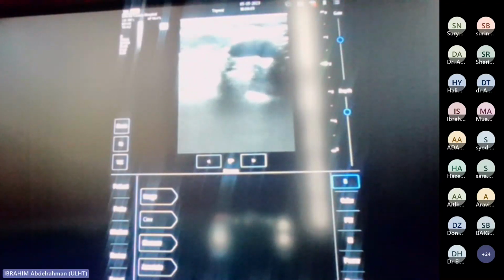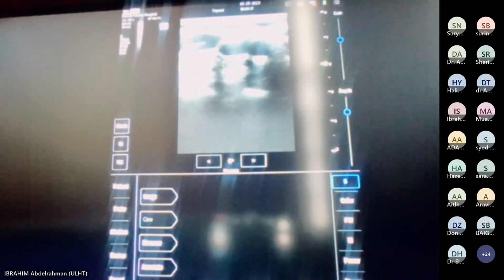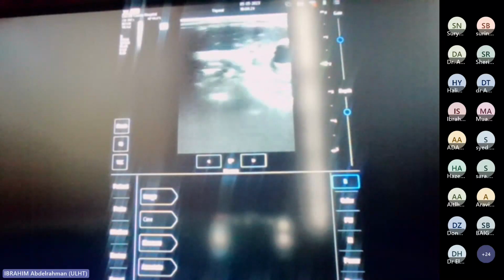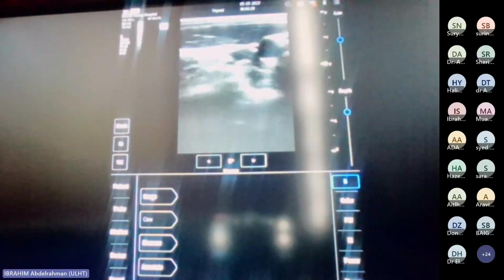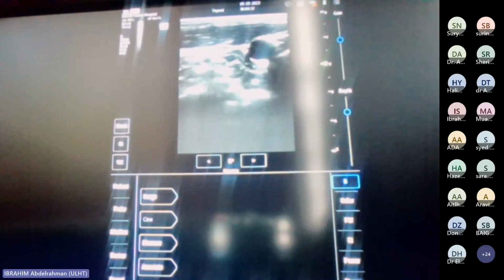So here we have the main blood vessels. Yeah, so the carotid, and that's actually the bifurcation. If you just sweep through that, see that coming together. So that's generally in most people at level 2, but it can bifurcate lower. Okay. So I find the SCM, there's SCM. And there's the transverse process just over there. So the useful part of the soft tissue of the neck is all anterior to that.